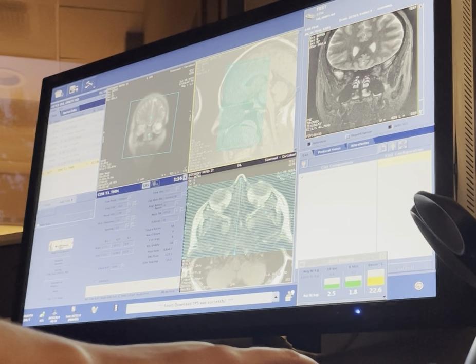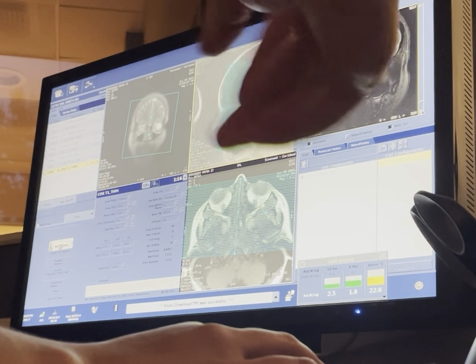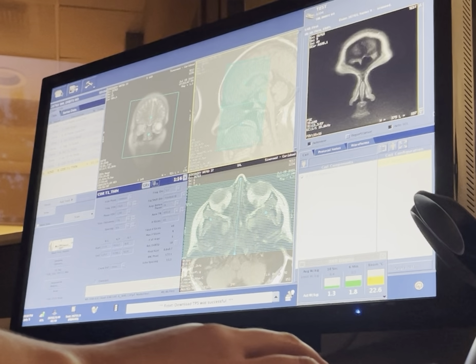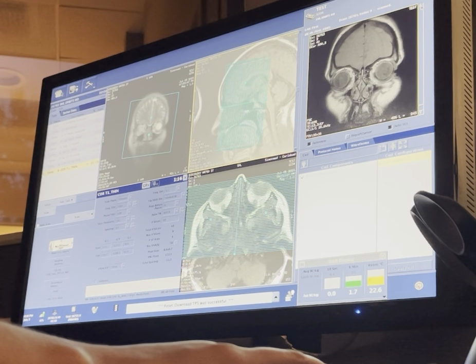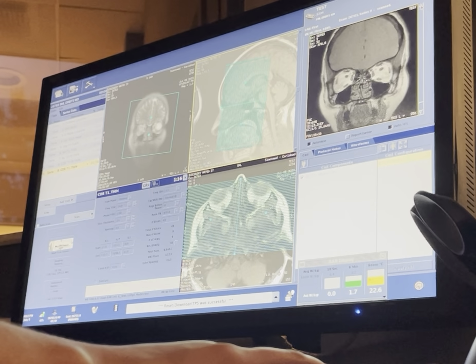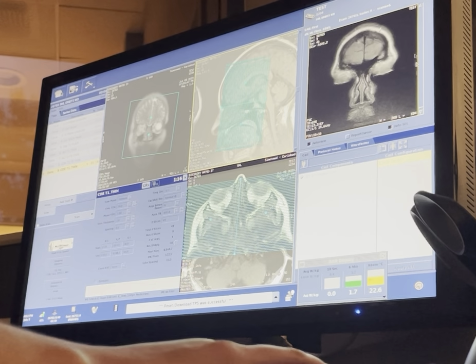Is that an artifact, right? That dark spot, go back down. It's at the eyes, right there. Could just be liquid. No, it's not an artifact. Okay, don't worry. I was just wondering. I don't know what that is, to be honest, but I'm pretty sure it's just the eyes. It's either liquid in the eyes or maybe her pupils. Okay, yeah, scroll all the way through.